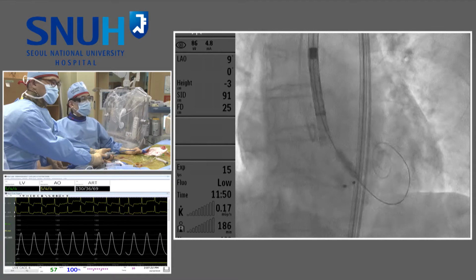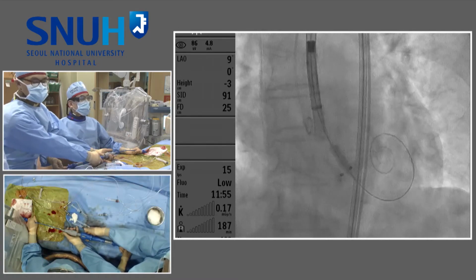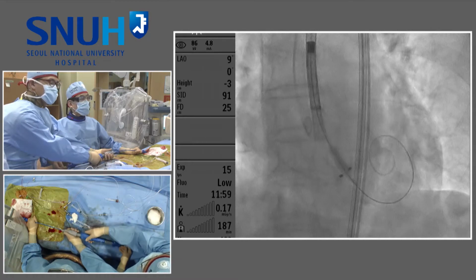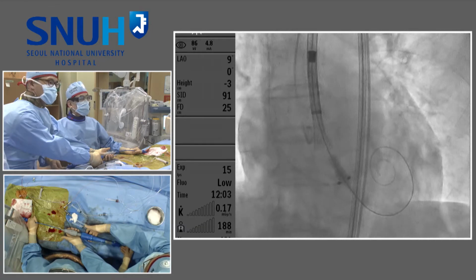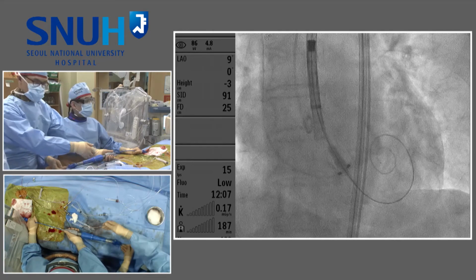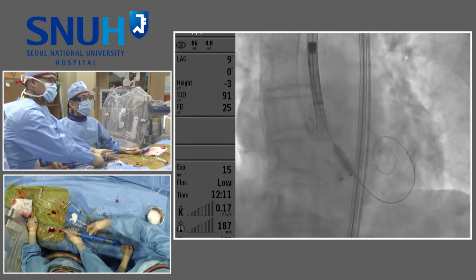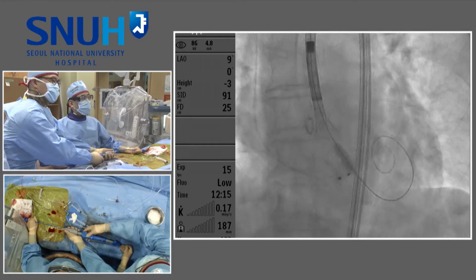This is very, very interesting what he just said. I don't know if you noticed the operators here in the audience. Not many people are doing it. Usually, the first operator is operating the valve, the second operator is doing the wire. What Dr. Kim is doing is fascinating and very important to mention, because you see the second operator is opening and he is controlling both the valve and the wire. And this is very smart.